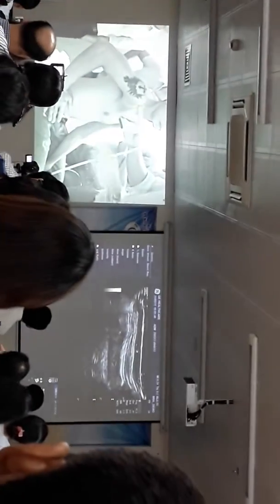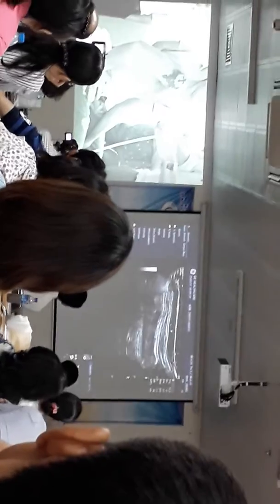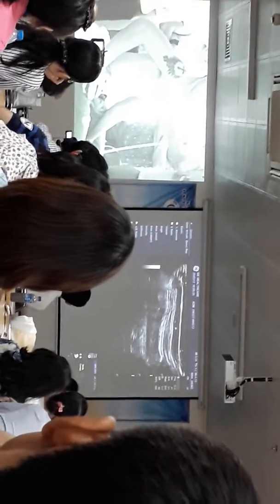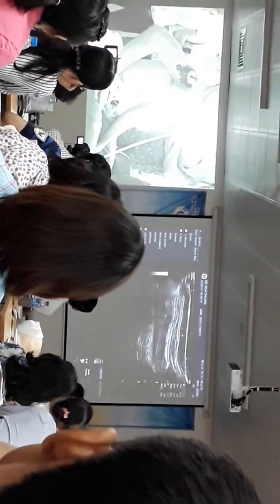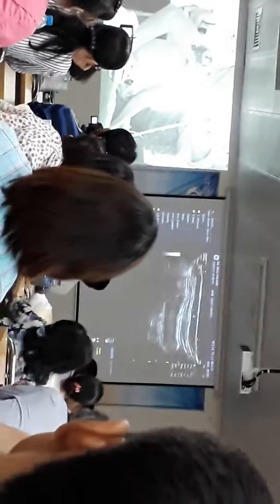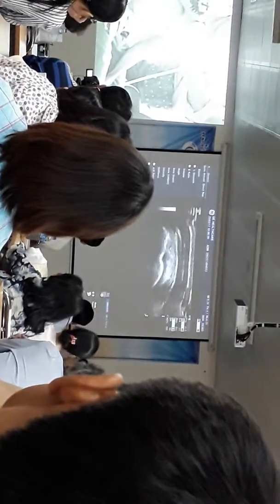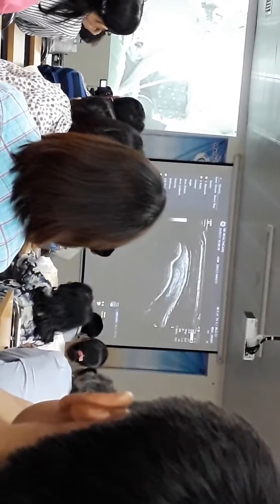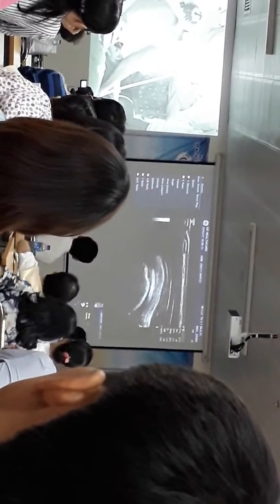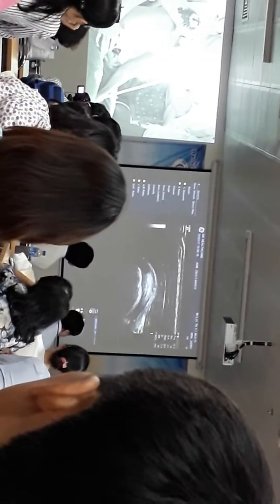And what that does, when the patient's elbow is out like a chicken wing, the tendon is quite short, but when you push the elbow back, that is pulling the tendon out and around so we can see more of it. This lengthens the supraspinatus and gives a wider area to examine.